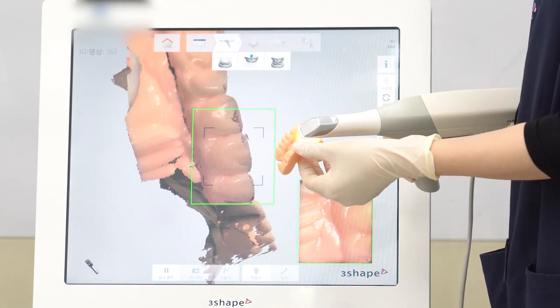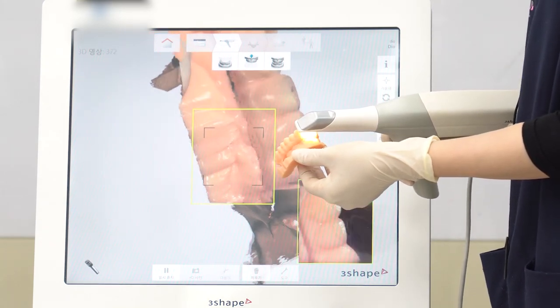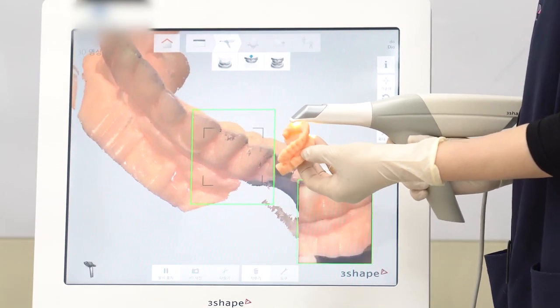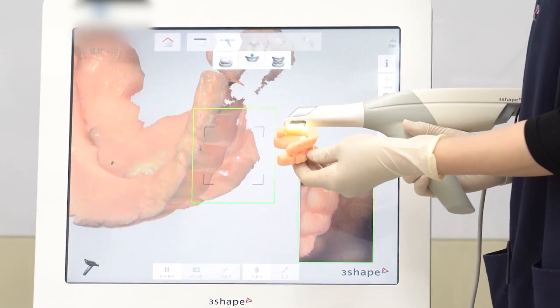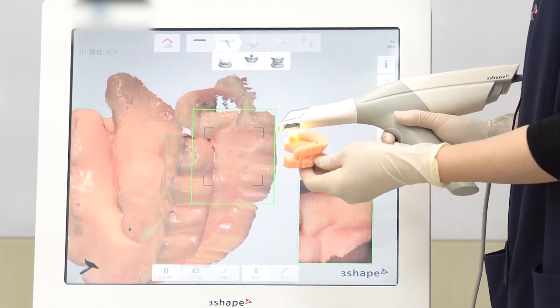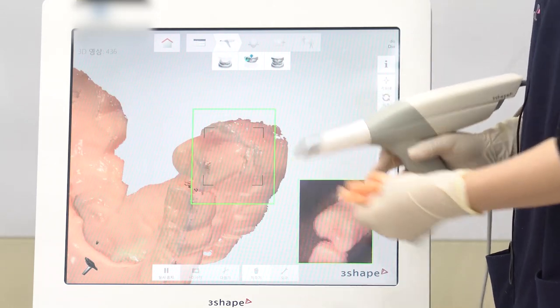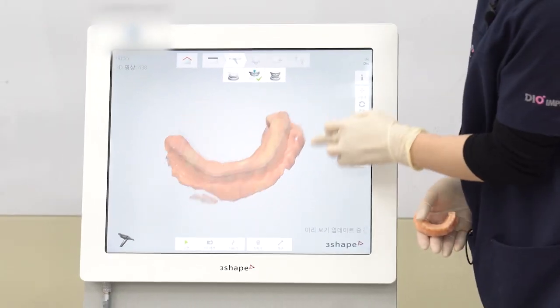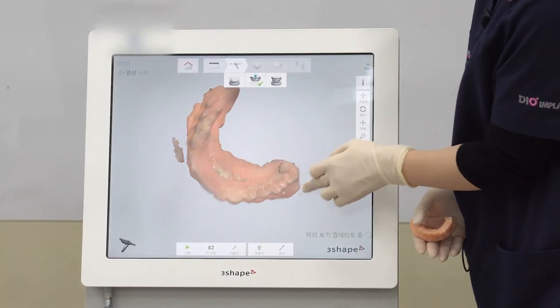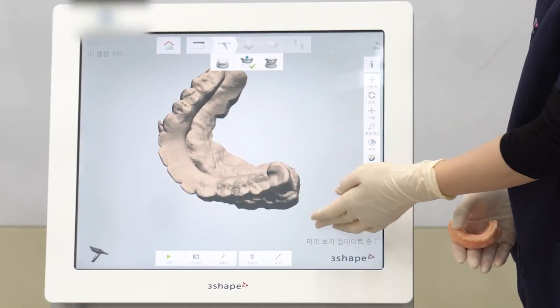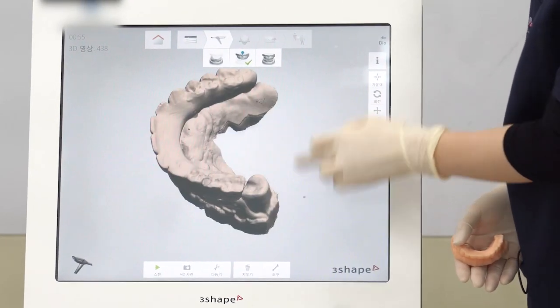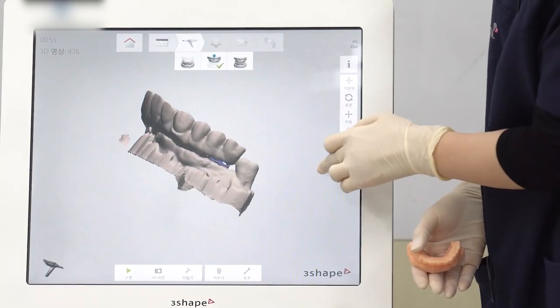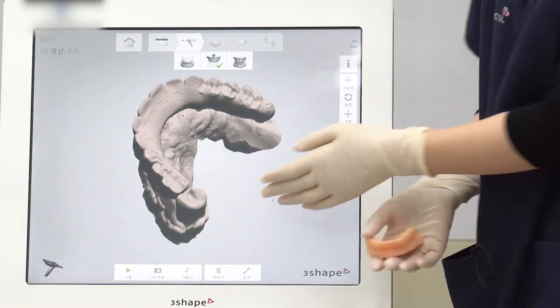When scanning the anterior teeth, be careful not to overlap the cutting plane. After scanning every part, check if all the areas are scanned well. Click on the surface button and you can more accurately check in black and white. When scanning the opposing teeth, the occlusal and buccal area must be scanned more accurately.